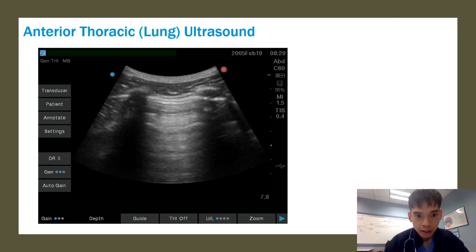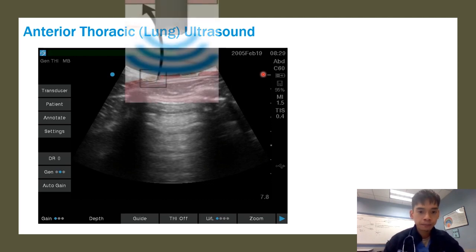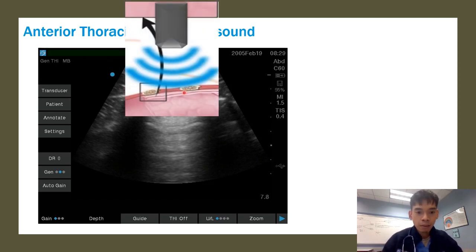So you can see some skin layers here. You can see some hypoechoic muscle layers here, maybe some pectoralis muscle going on. And then you have some shapes here. If you're able to intuitively figure out what these two shapes may be, I've tried to highlight that in the previous slides. And here it is. So imagine those shapes being the rib cages right here. Again, we're going to get some ribs as the ultrasound beam comes down, okay?